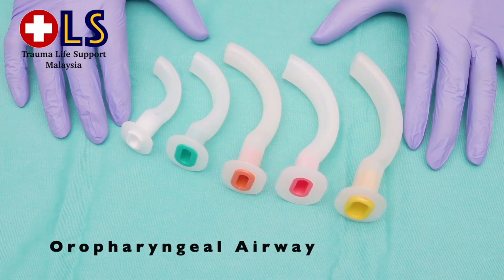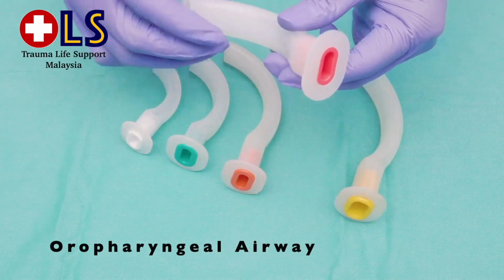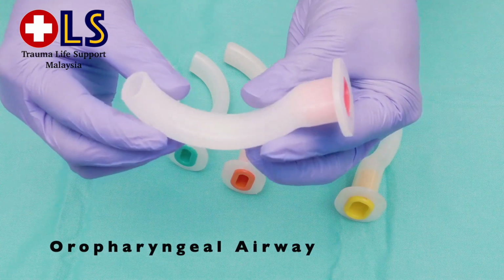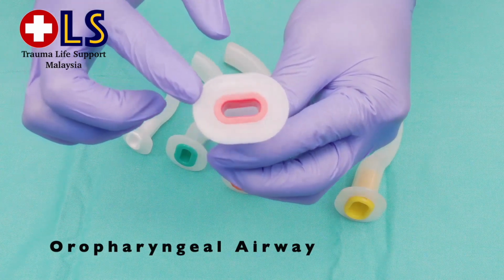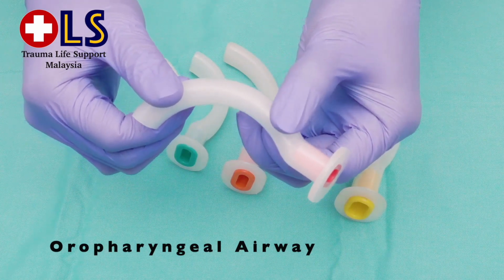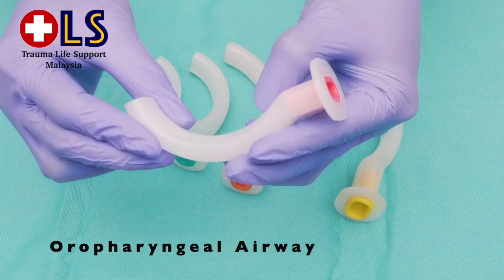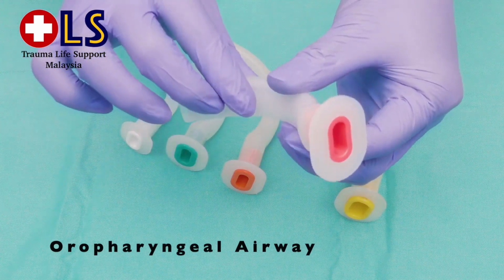This is Oropharyngeal Airway. It is an adjunct to obtain and maintain airway opening in unconscious patients with no gag reflex. It helps to relieve airway obstruction by moving the collapsed tongue and hypopharyngeal structures forward. It comes in various sizes. This OPA needs to be properly measured before inserting into the patient's airway. It can worsen airway obstruction if the size is too small because the distal end of this OPA will be blocked by the tongue. If it is too big, it can cause traumatic injury to the surrounding area and laryngeal spasm too.